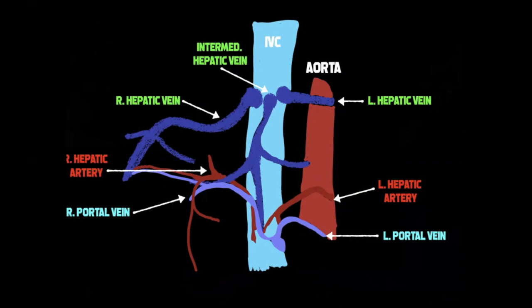So with the probe position, with a bit of alteration, we'll be looking at all of those vessels together, and we're focusing again on portal and hepatic vein flows with Doppler. Normal hepatic vein flow looks something like this. We get our subcostal view of the liver. You can see the vessels highlighted nicely. Colour them in, strip them off, and you can see you've got your IVC and your hepatic branches coming through.